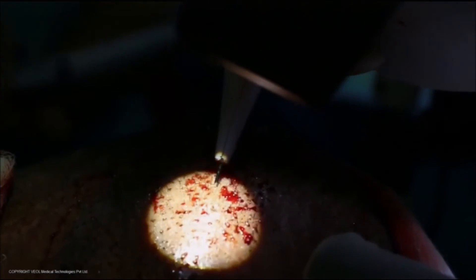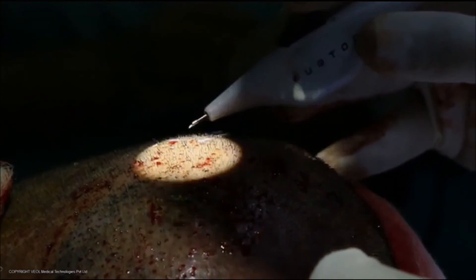As you can see, the graft can be loaded into the implanter and delivered into the slit in less than a few seconds.